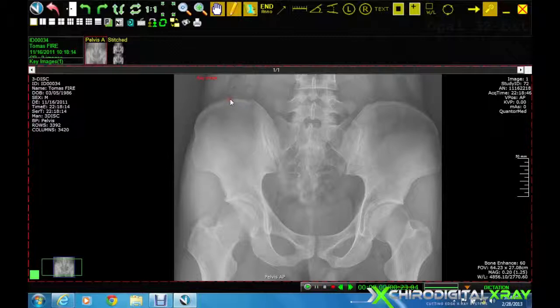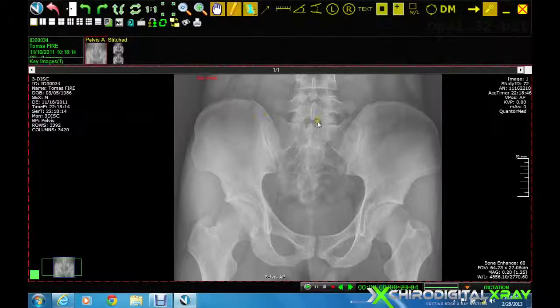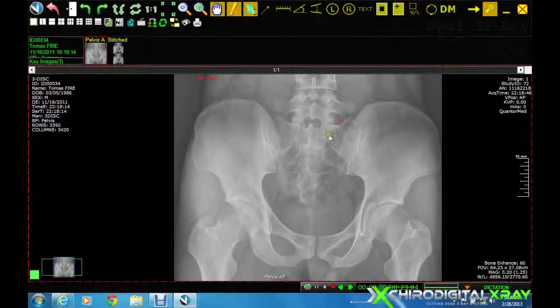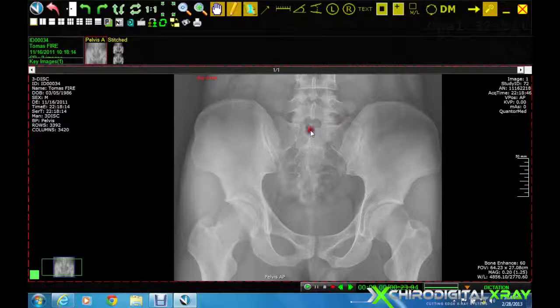First point placed at the top of the left iliac crest, followed by the right iliac crest, the left sacral notch, and the right sacral notch, then the first sacral tubercle.